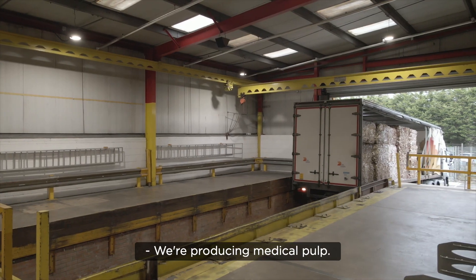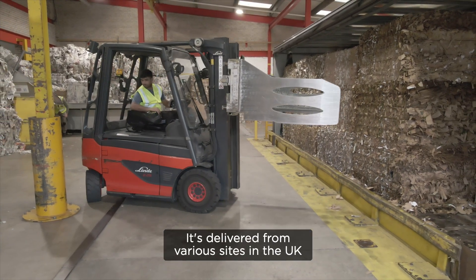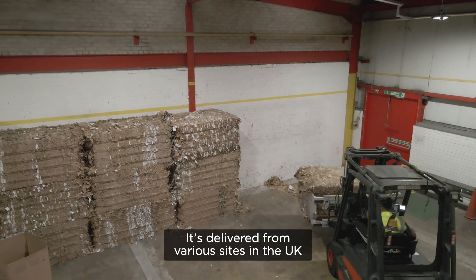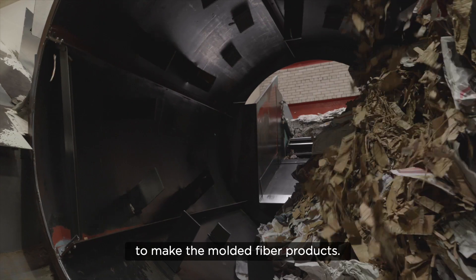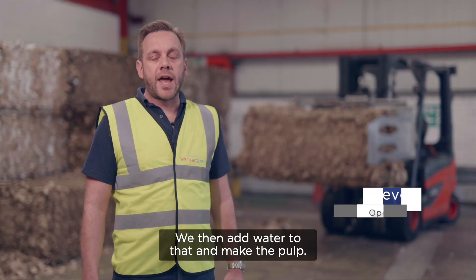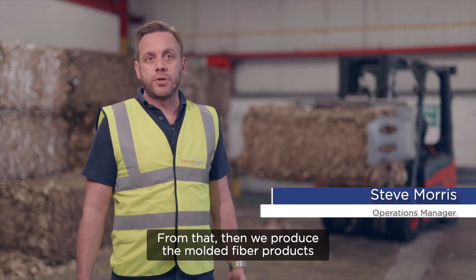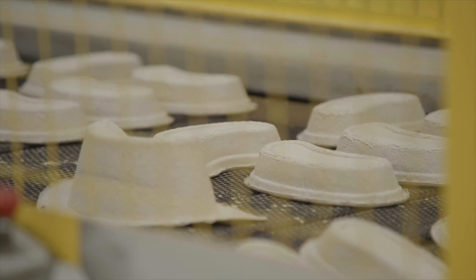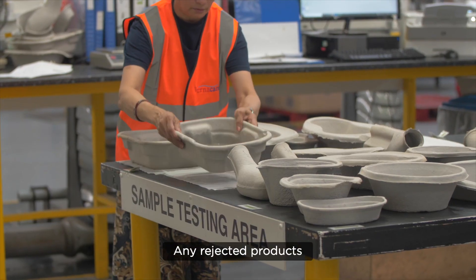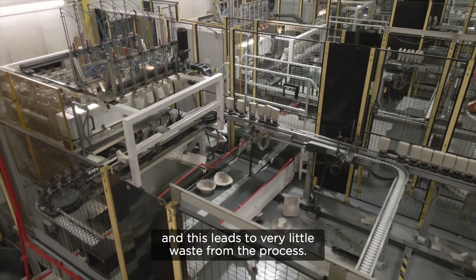We're producing medical pulp from 100% recycled cellulose fiber. It's delivered from various sites in the UK directly to ourselves, then fed into our system to make the moulded fiber products. We add water to that and make the pulp, then produce the moulded fiber products using vacuum technology. Any rejected products are fed back into the system and repulped, leading to very little waste from the process.